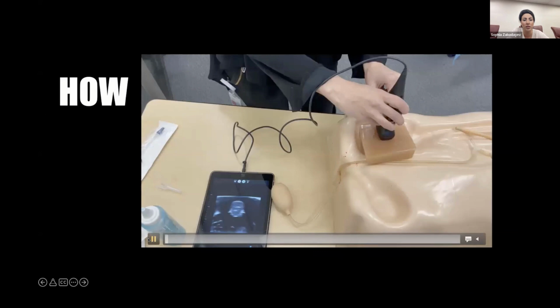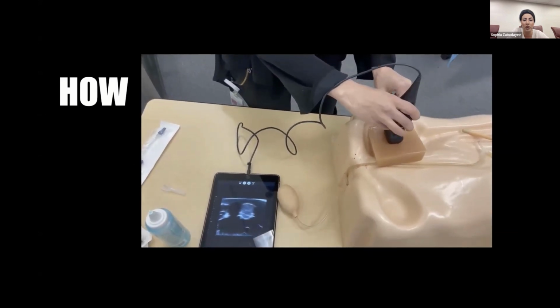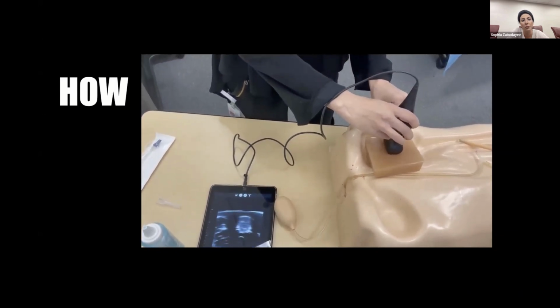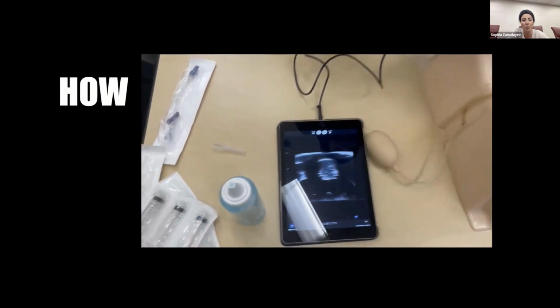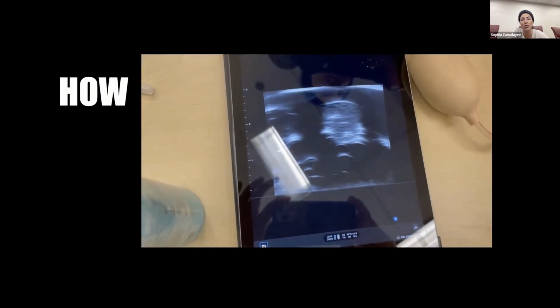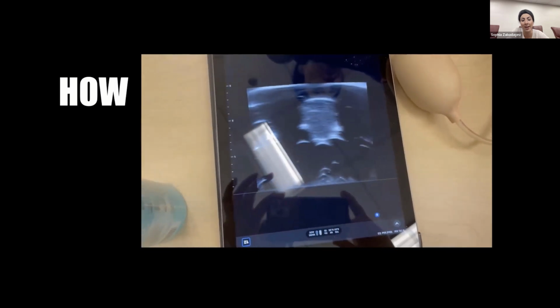And then here's just a little video of me scanning one of the models at the time, trying to look at the vessels and the nerve under ultrasound using our Butterflies. And to make sure that the needle also was visible, you could see the needle just coming in there next to the nerve, to try to simulate as realistically as possible what it would look like to inject in that region and deposit the anesthesia.